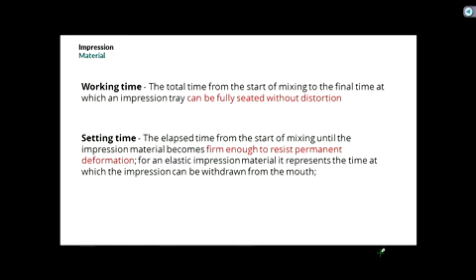So you'll find if you take a little bit too much time, and one material starts to set before the other, as you remove the impression and analyze it, you'll see the two materials separate because one has already started to set up. Okay? So you've got to work within this working time. On the cartridge that you have, it'll have a working and a setting time on there. So I believe it's 2 minutes, 2.5 minutes, something like that.